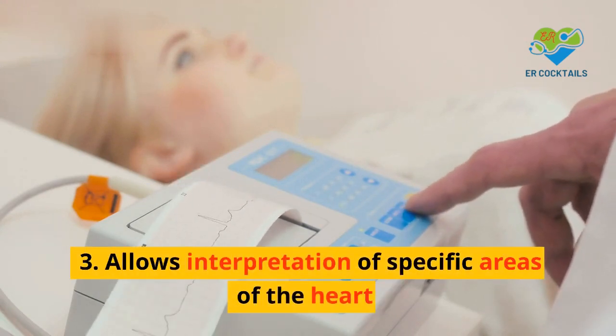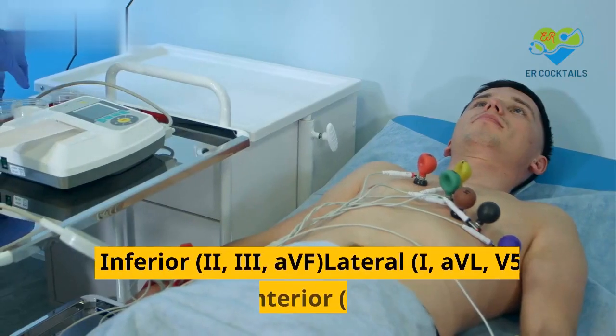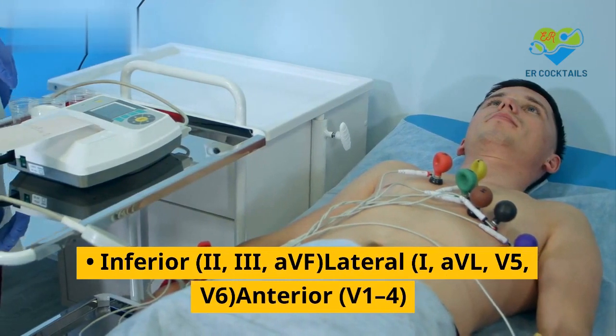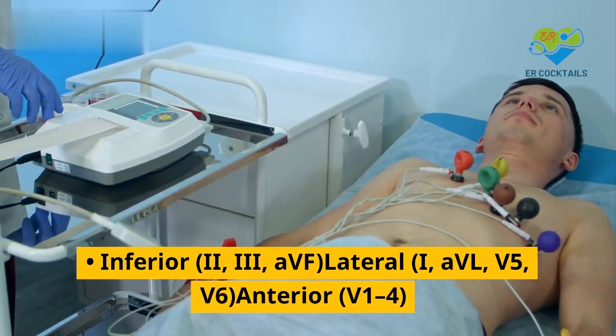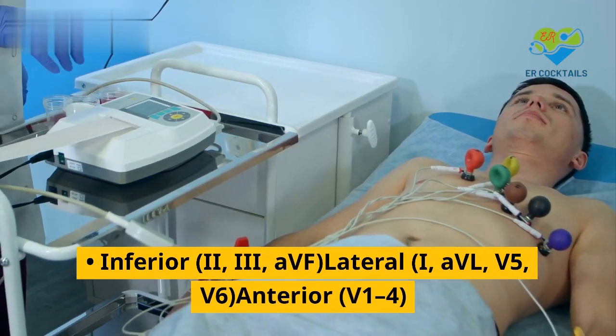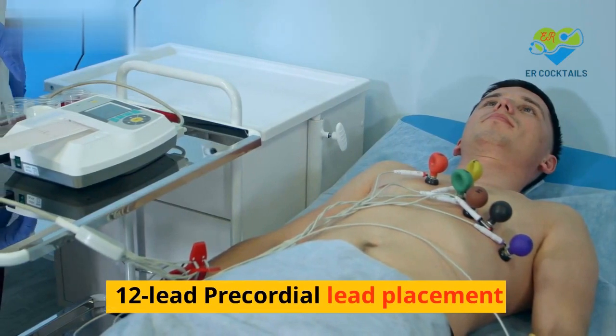3. It allows interpretation of specific areas of the heart. Inferior: II, III, aVF. Lateral: I, aVL, V5, V6. Anterior: V1 to V4.